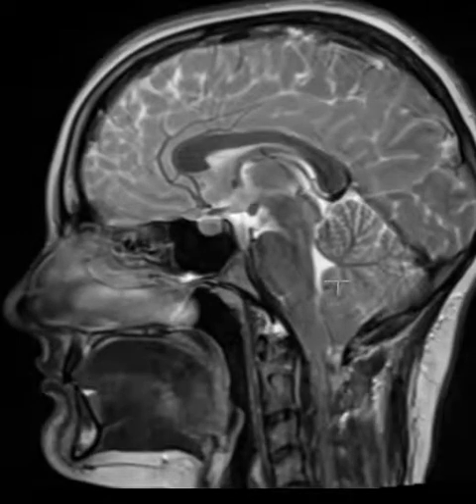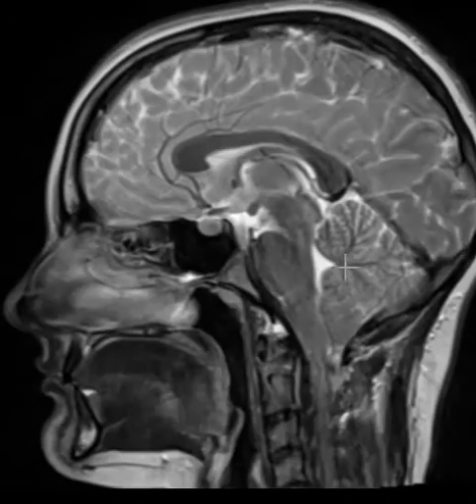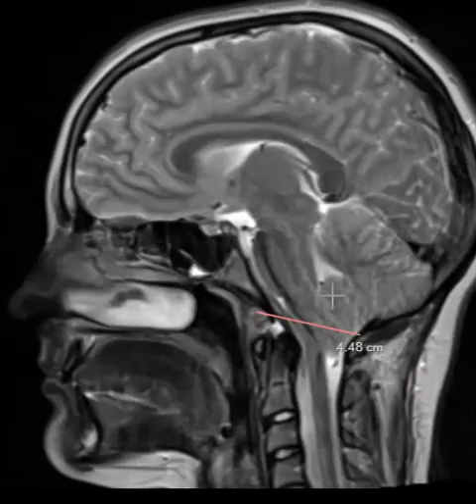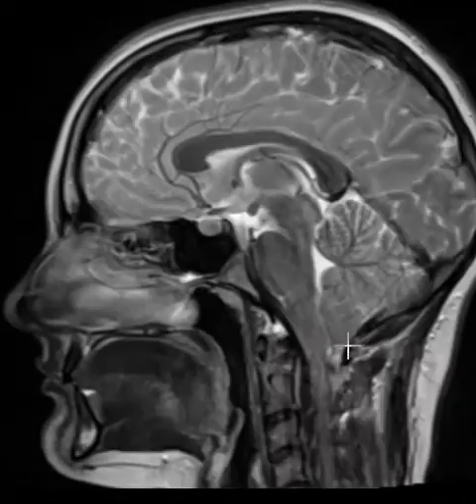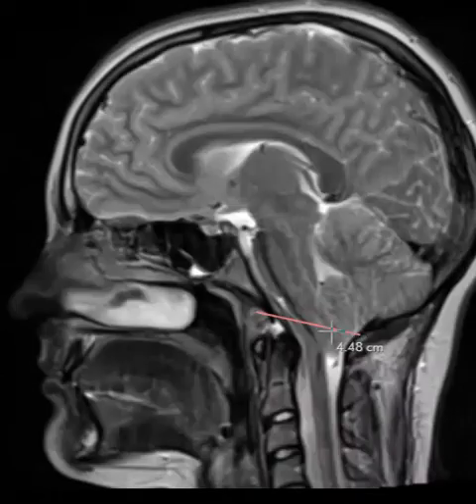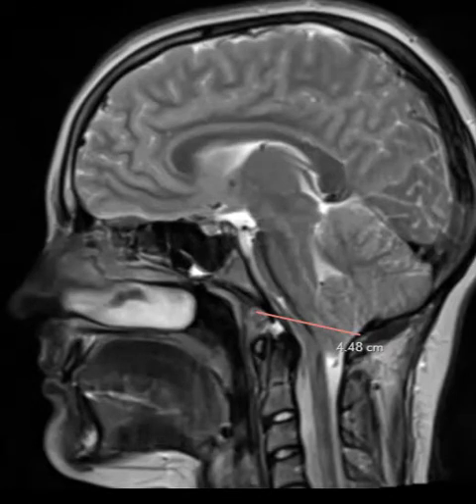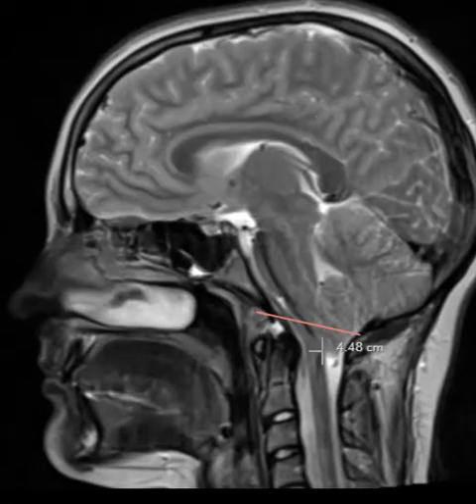Chin. We also see something that we didn't expect, which is the cerebellum back here. It has what we call tonsillar ectopia — the cerebellar tonsil, which is here. It goes down too low through the foramen magnum, and the foramen magnum is the junction between the brain, the intracranial contents.